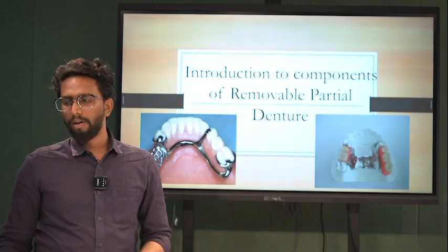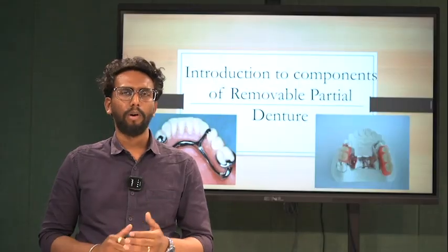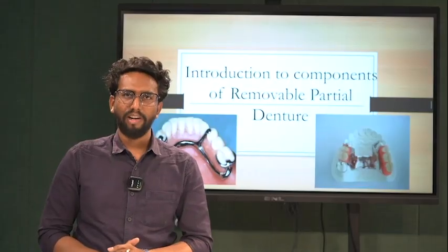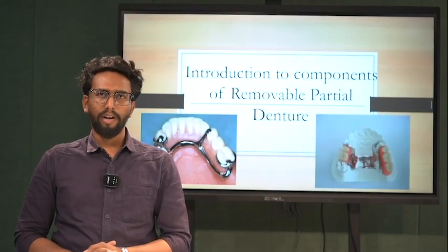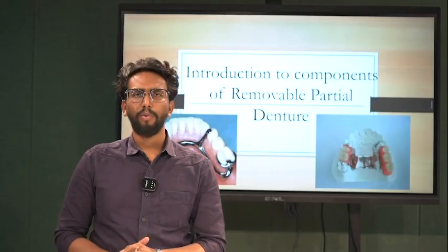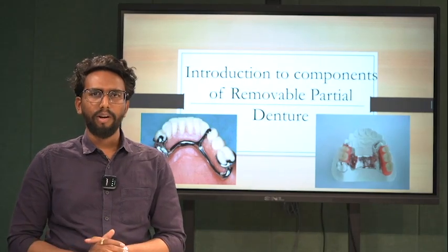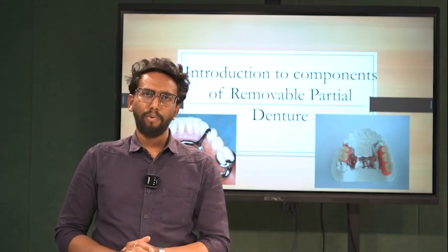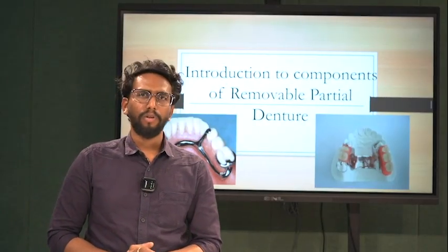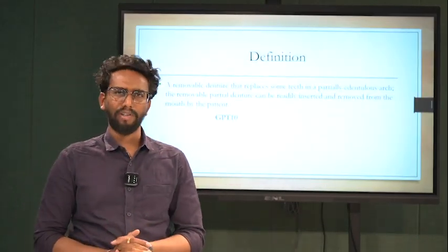In this lecture, we will learn about the different components of removable partial denture. It is an introductory lecture, because fabrication of removable partial denture is a little bit of a tricky part. Unlike complete denture, in removable partial denture, we have to plan and position each and every component precisely so that it can improve the treatment outcome for the patient and also give the utmost aesthetics in the removable partial denture. So what is a removable partial denture?